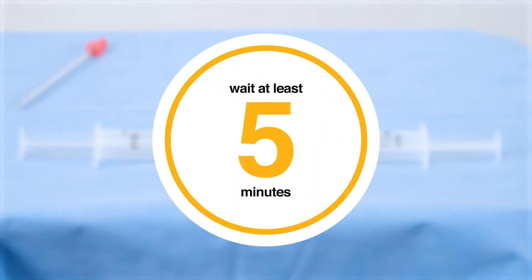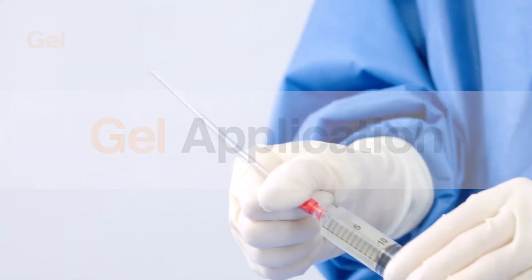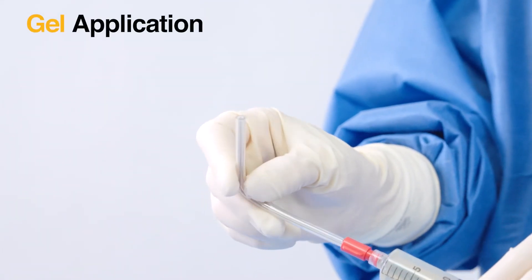Stop. Wait at least 5 minutes for the gel to reach the right consistency. The Kytogel is now ready to be applied using the malleable cannula.